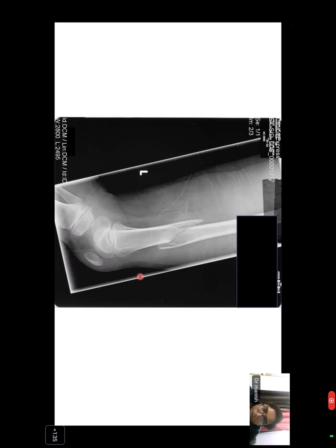So Manish, if I want to correct you here, this is the second part where you have to tell what the lesion is doing to the bone. The first question is where is the lesion? Do not jump on the fracture straight away, because that is very obvious. Do not miss the most important part here. It's a diaphyseal lesion. I think if you go in a sequence, it always helps. What is the zone of transition always helps.